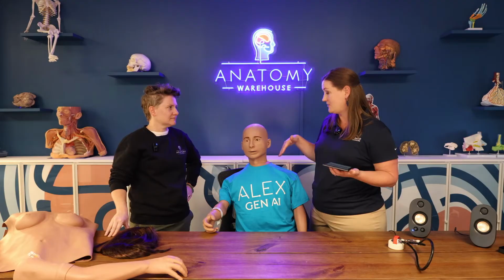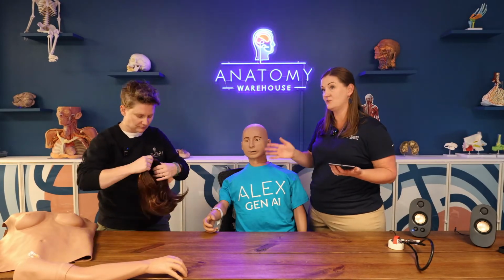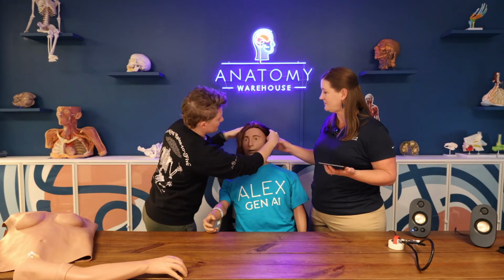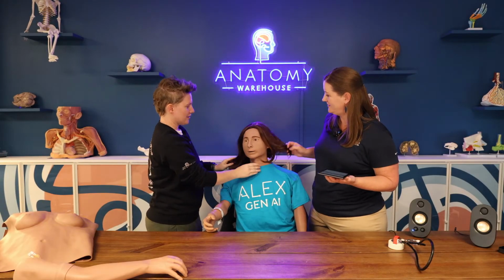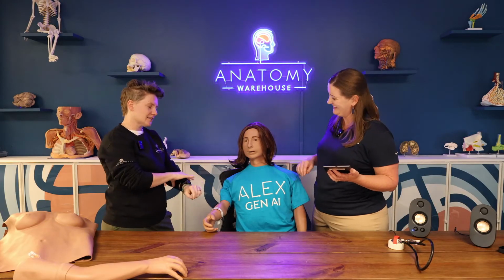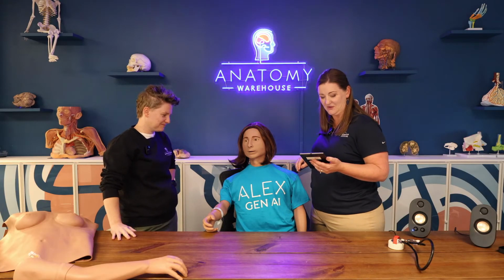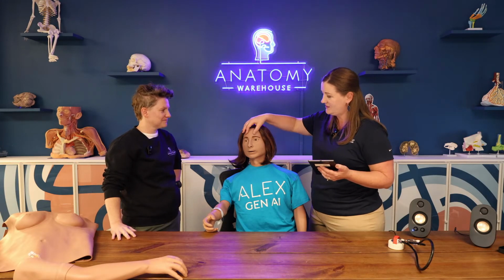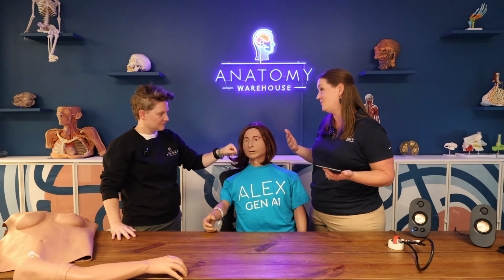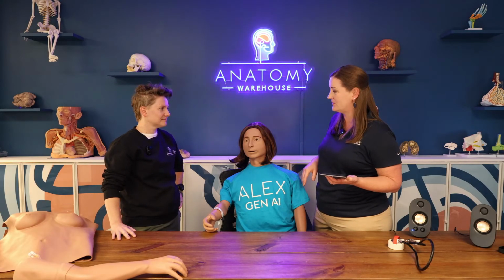Alex or Vivian can be set up to be just sitting and waiting as the students are doing any kind of assessments. Oh yes, we're Vivian, so we should have her hair on. It's a pretty nice set of hair you've got there, Vivian. She's got some nice highlights and a little side part. The eyelashes lacking is throwing me a little bit, but no problem. You can put a bunch of stuff on here. The face of the mannequin is actually a silicone base, so it is responsive and does well with any kind of moulage or makeup. We've seen customers do all sorts of things with Alex.